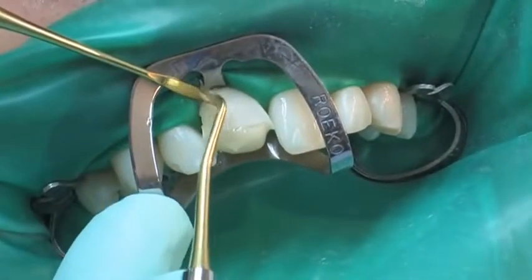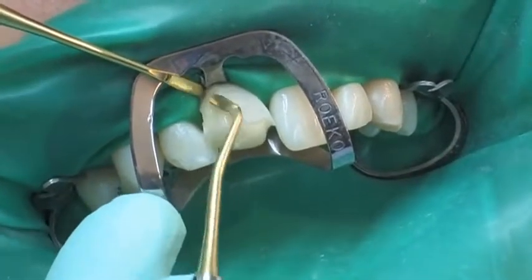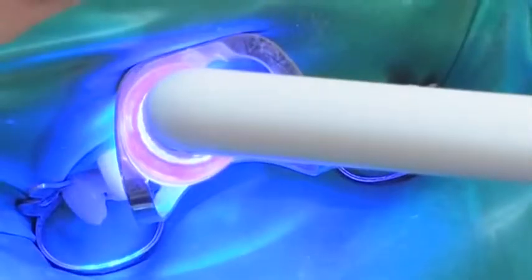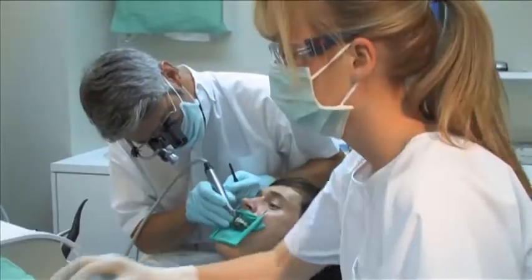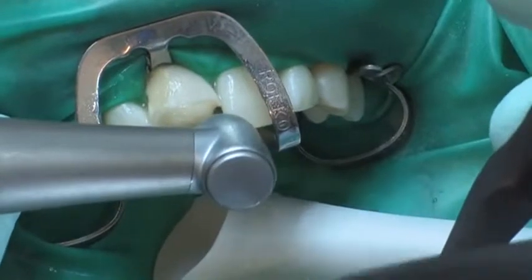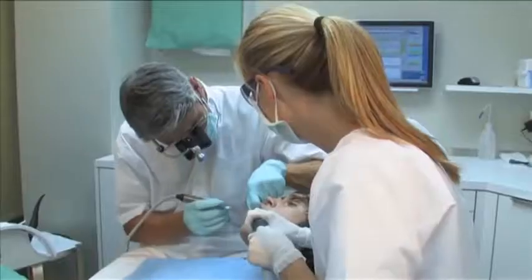A small increment of composite is applied, sculpted and polymerized. The bulk crown preparation is performed using a 125 micrometer diamond instrument.